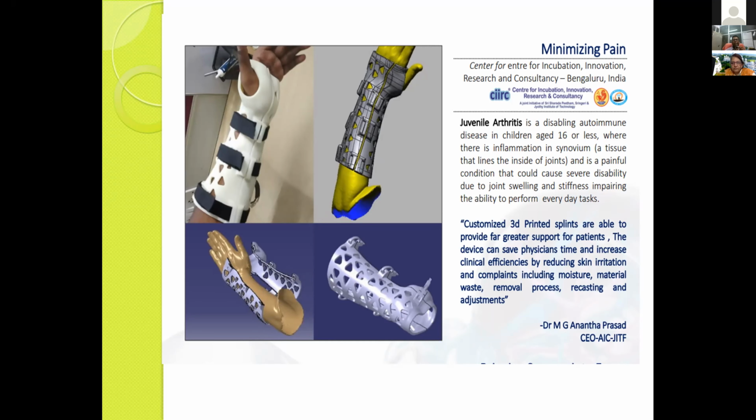Yes, ma'am. If the patient is there, you can utilize the lab scanner for directly scanning. Basically, a lab scanner means it is scanning the outer areas. That is the theme. Whether you are directly scanning, like their faces because the patient is there, it is a little bit different in the dental area, because conventionally we are solving problems using a fixed kind of process, which makes some difference if we think about intraoral scanners.